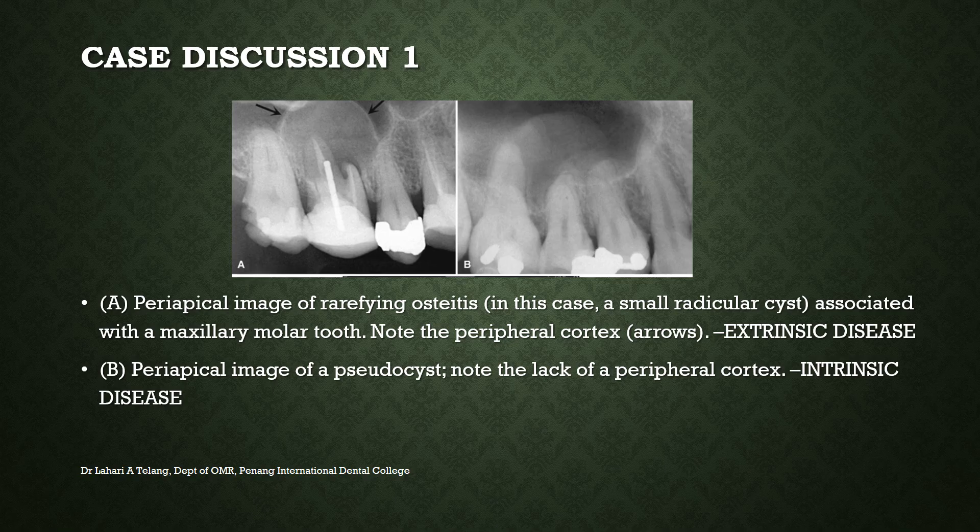Looking at two intraoral periapical radiographs: image A shows rarefying osteitis with radiolucency at the apex of the mesiobuccal root, possibly a small radicular cyst, along with a large radio-opacity with a peripheral cortex impinging into the sinus. Image B shows a pseudocyst, with no peripheral cortex, indicating disease originating intrinsically within the sinus floor itself, while the periapical regions of the premolars and molars appear fine.